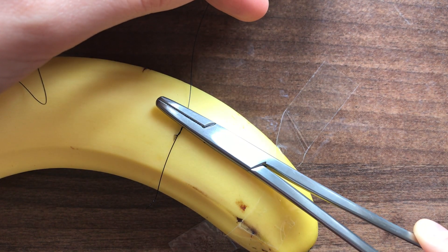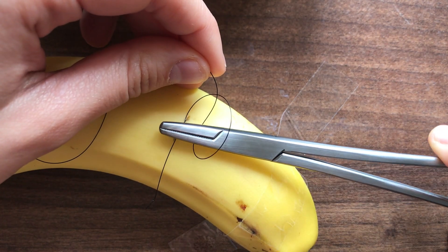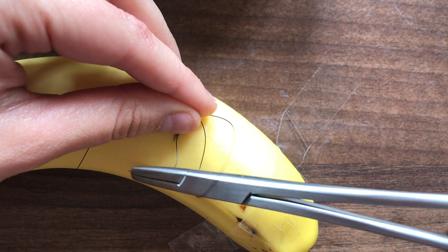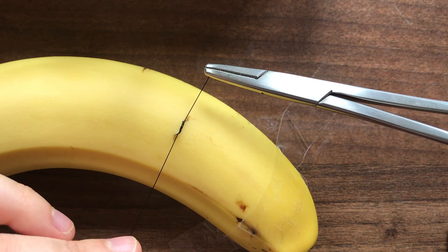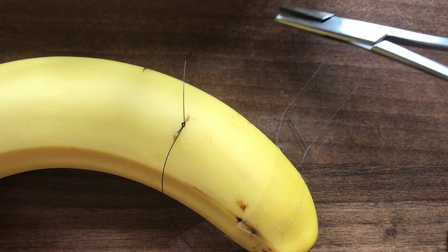Release it, then put your needle holder in the middle again. This time you only do one throw. Again hold on to the tip of the short end and pull it back the other way, with your hands crossing over as they were with the hand ties.